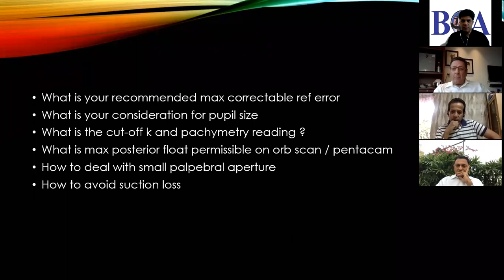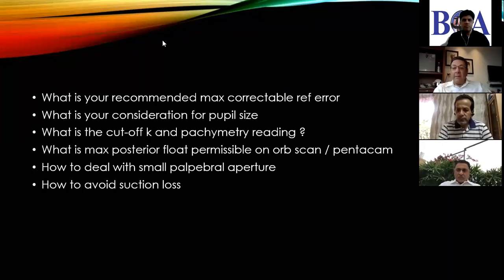So, Barjot, is your TopoLink giving you a mesopic pupil or a photopic pupil? No. In the dark, actually. Okay. So, you're taking that as your cutoff. Yes. Because it's no big deal if you do it in lit conditions. So the room is completely dark.